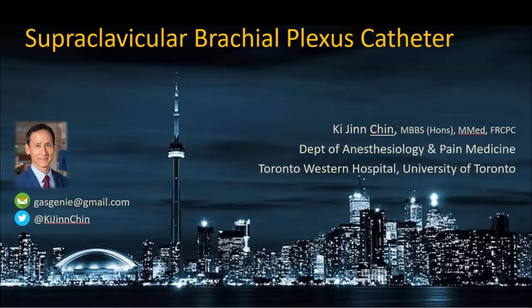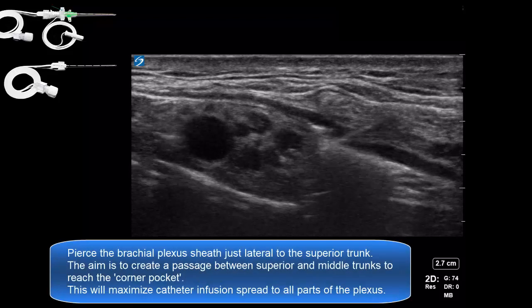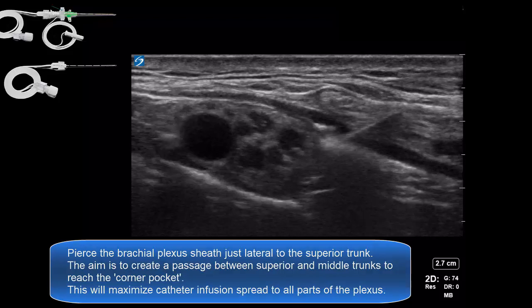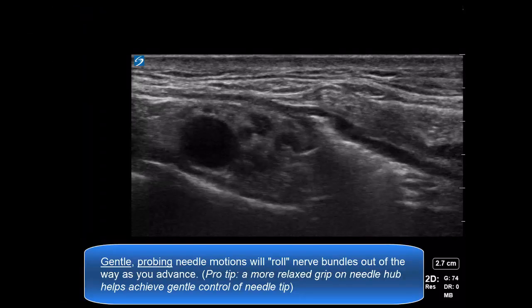This video illustrates the insertion of a supraclavicular brachial plexus catheter. Here we're using a catheter over a needle device. The aim is to pierce the brachial plexus just lateral to the superior trunk and make our way towards the corner pocket.